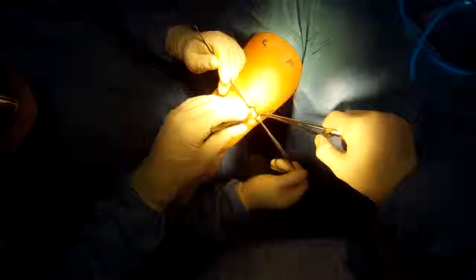First I'm going to find the ulnar nerve. See, if you don't release the ulnar nerve, as you increase flexion after trauma, the scarring about the nerve will often lead to pain and symptoms of numbness in the small finger.